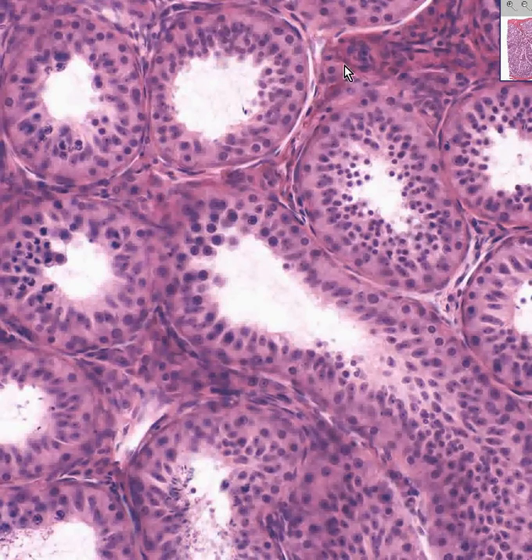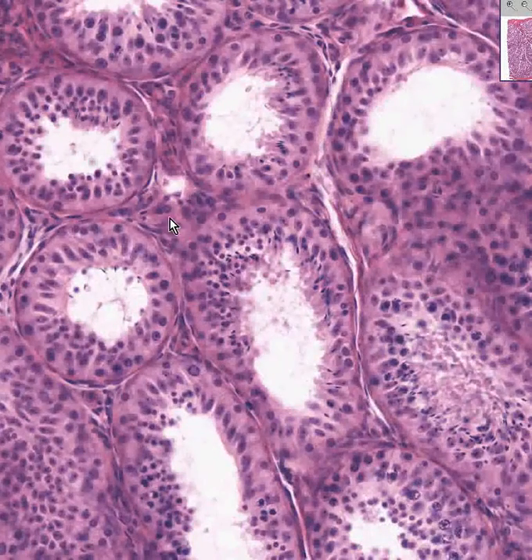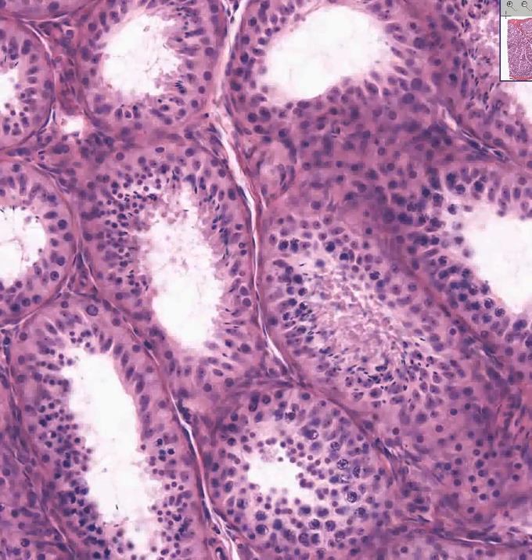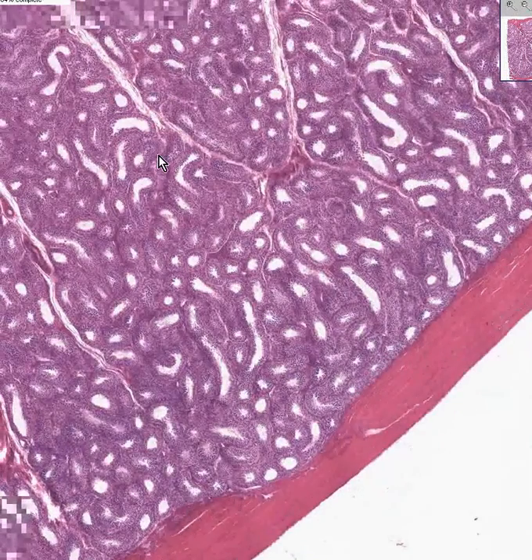They're much more common in old age, and sometimes they're harder to see. But any cell in the interstitium which does not look like a fibroblast and has a good amount of cytoplasm, often a little bit redder than the rest of the cells, and certainly not spindly, is probably a Leydig cell. In addition, if you could see a couple of tiny little crystals in here by zooming way up, then you know it's a Leydig cell. So much for the capsule and the seminiferous tubules, which is the vast majority of the testis. Let's now go into an area which is referred to as the mediastinum of the testis.